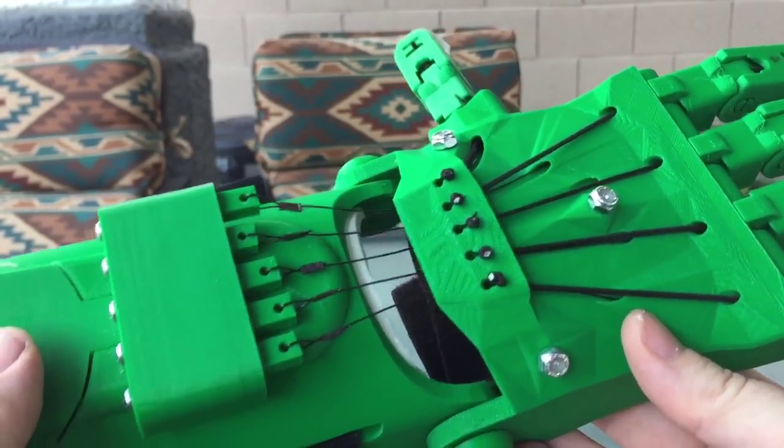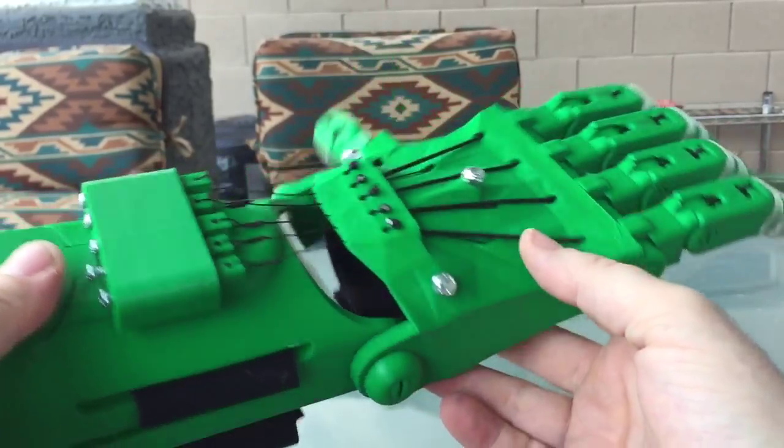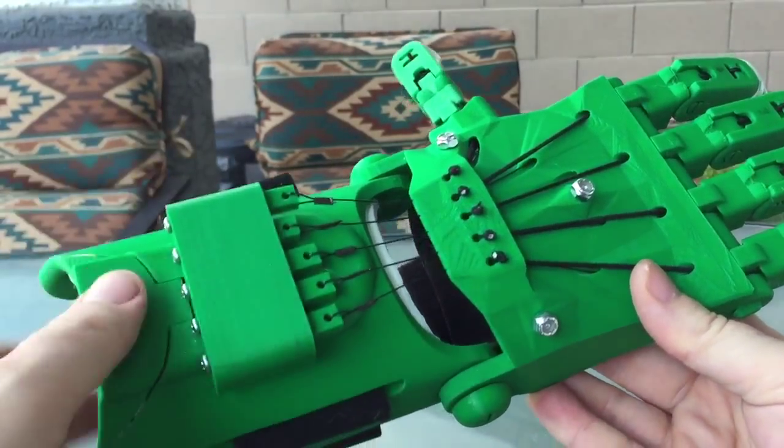I think I spent about an hour or two trying to put the Kevlar fishing line on — tie it, re-tie it, cut it off and do it again. So this is all complete with the fingertip grip section. Do some adjustment here.